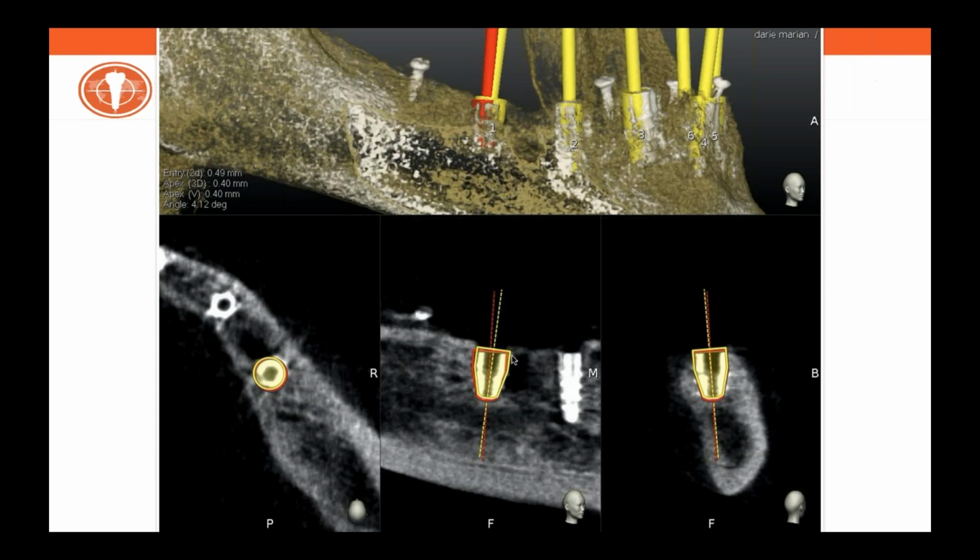Most of the literature which has been produced lately has used, as you know, Mimics as a software. Mimics is considered a gold standard in the literature. And this software, which is Evalunav, does exactly the same, but it's free. It's completely included into the ecosystem of Navident.